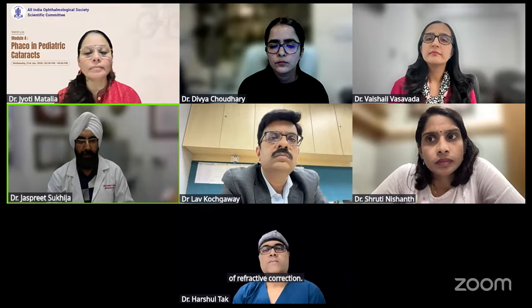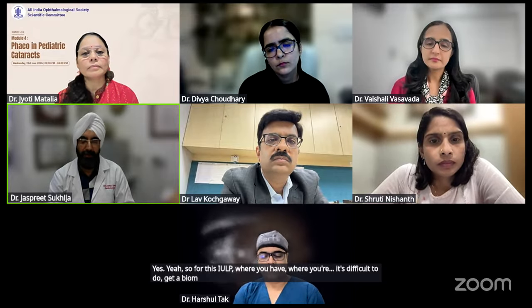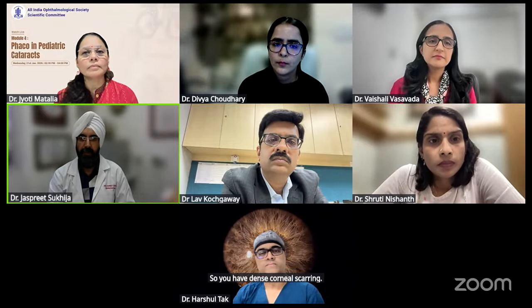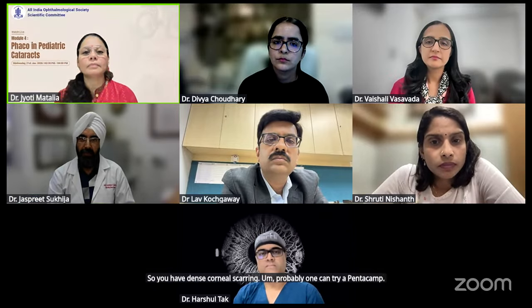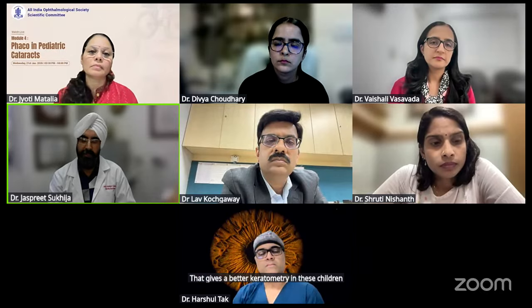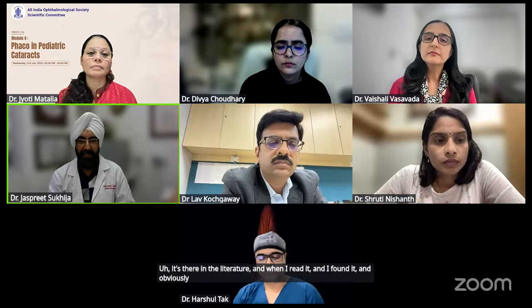For these IOLs, it's difficult to get a biometry with the optical biometers where you have dense corneal scarring. Probably one can try a Pentacam. That gives a better keratometry in these children as compared to just doing a routine biometry. It's there in the literature, and when I read it and found it, things changed for me when I have such complicated cases.